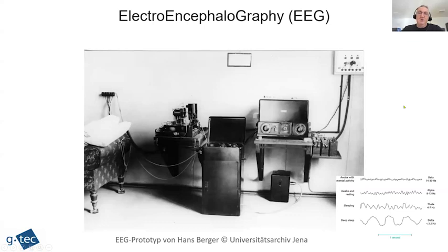About the EEG, you are hopefully already much more familiar with an EEG after these 3 first days, if not before. Just as a small curiosity, you're looking at the very first EEG device. So all this is the EEG device, and it had only few channels. If you compare that, for instance, to our unicorn, which is probably the size of this knob, you can see how much the technology advanced in 101 years.